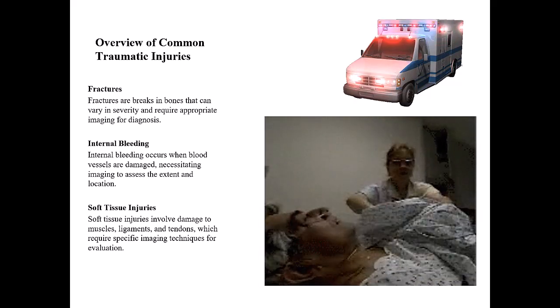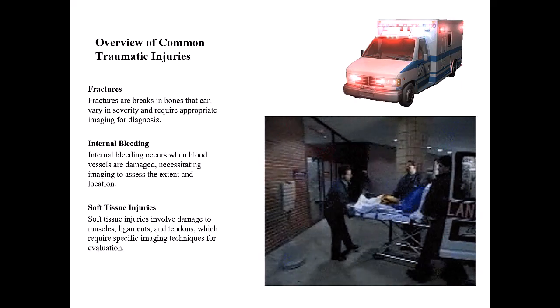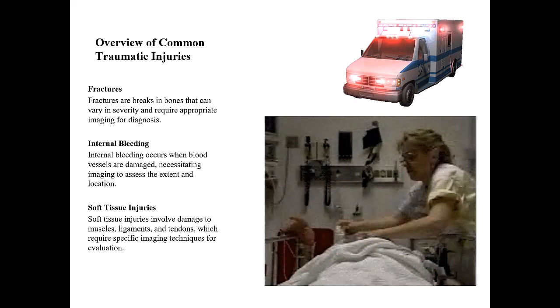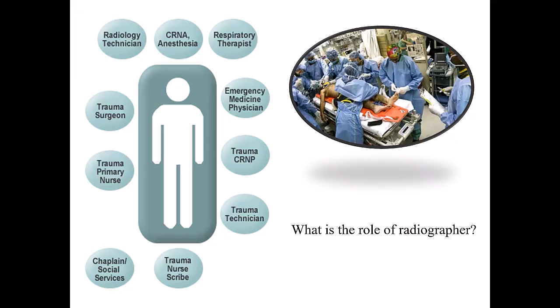Understanding these injuries helps radiographers tailor their imaging approach to provide the most relevant information as quickly as possible with the least amount of trauma to the patient. This is an illustration of the ideal trauma team structure with team member positions in relationship to the patient.